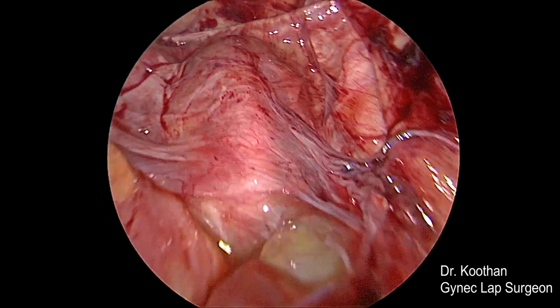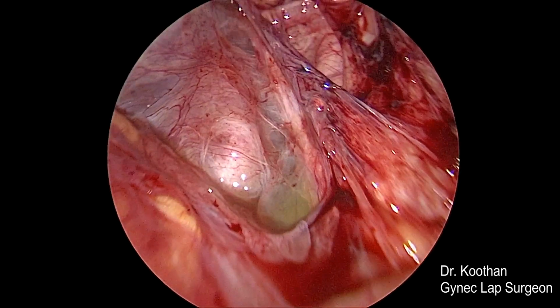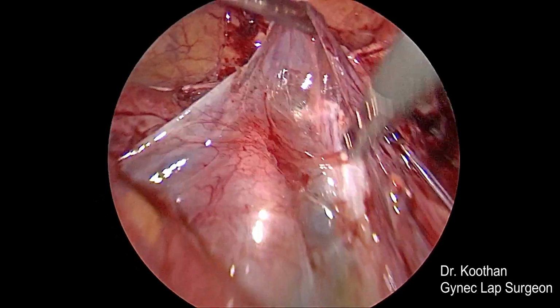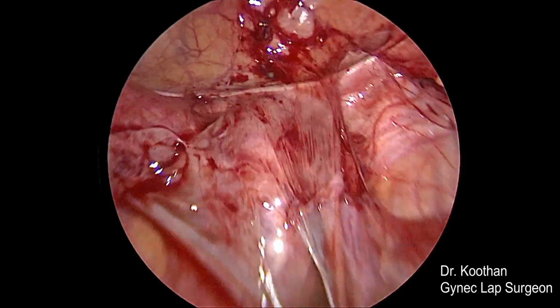The structure which you can see behind those flimsy adhesions is the huge right side Pyosalpinx. It's a very huge Pyosalpinx on both sides. What you can see is the Pyosalpinx full of pus inside.